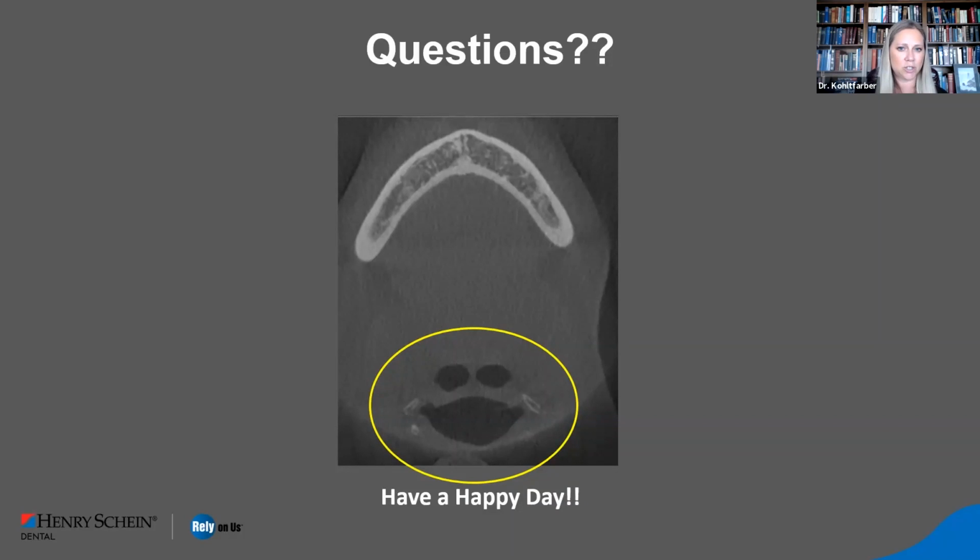After you place the implant, make sure that they try to put it in the right place. You may not need that. 2D imaging might be just fine right immediately after, unless you feel that something has gone wrong. Then CBCT would definitely be helpful for that. Usually, you've taken it ahead of time. You go ahead and place the bone graft. If you take a 2D afterwards, just make sure you've got it where you think you have it, and then let it sit for a little bit and come back and take it again. But if anything has gone wrong during your procedure, if you do not feel confident about it, you can go ahead and retake that as well.